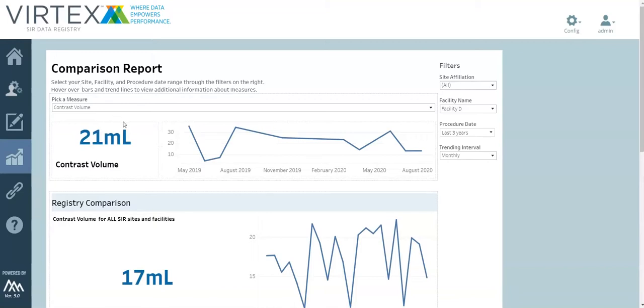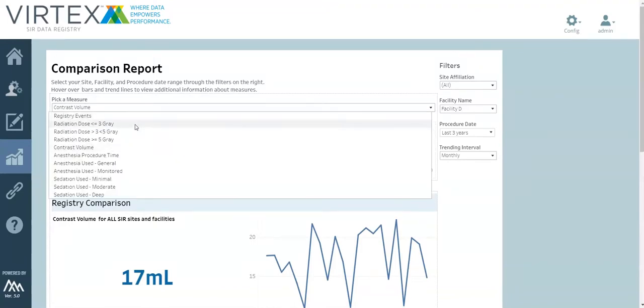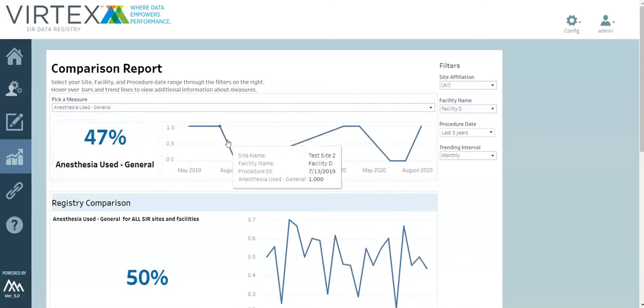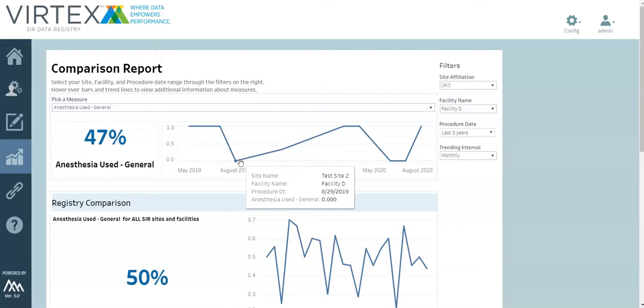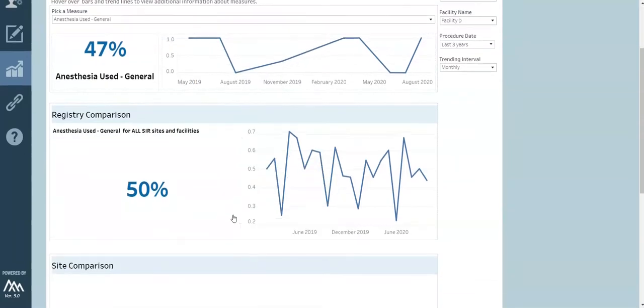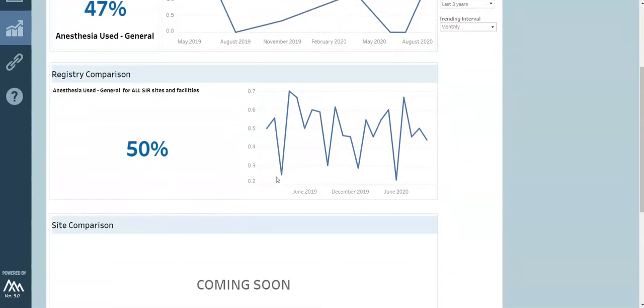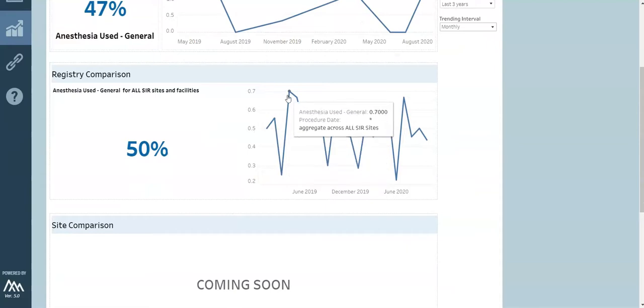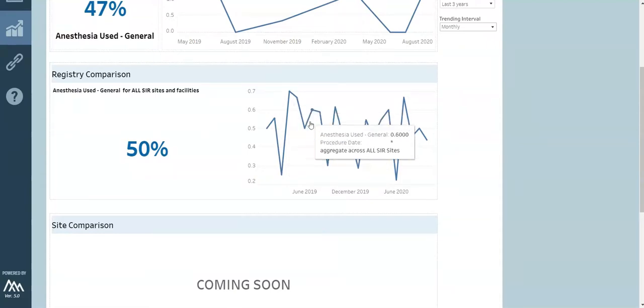Next, we'll turn to the comparison report. This report is especially helpful when benchmarking against other sites and facilities. You can select your measure of interest and see it trended over time. Below, you'll see how your site compares to all SIR sites and facilities. Additional site and provider comparisons will be coming soon.